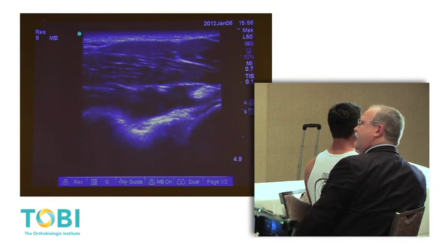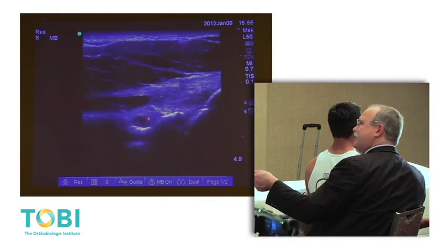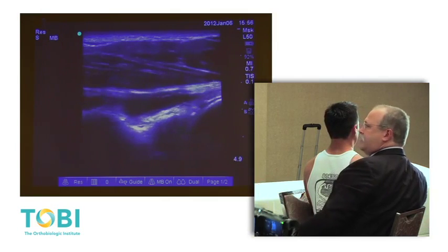Now bring your arm out, externally rotate. Let's see if he's got one of those veins. There, you see the vein distend right there? Now bring your arm back across your tummy and it flattens out. So make sure you do that in internal rotation. That's a shoulder study.